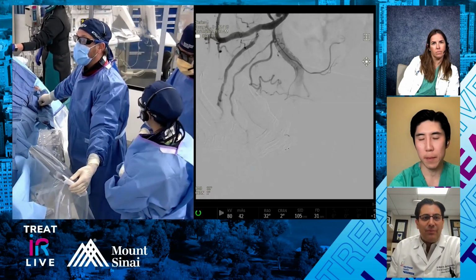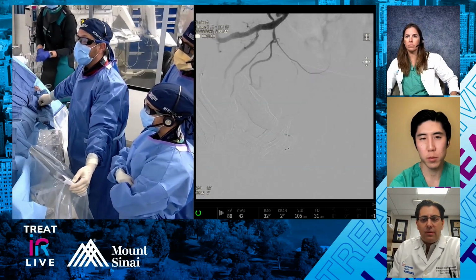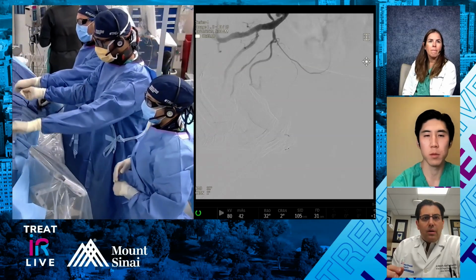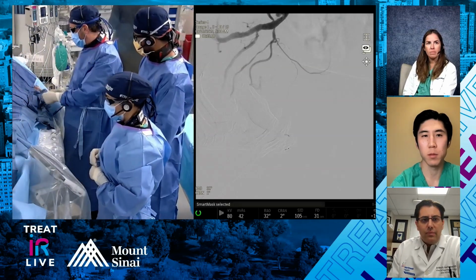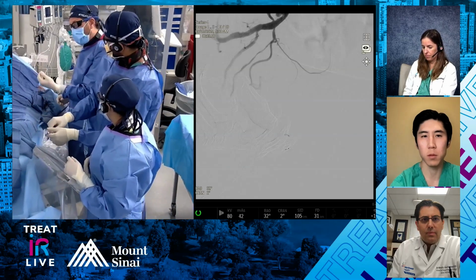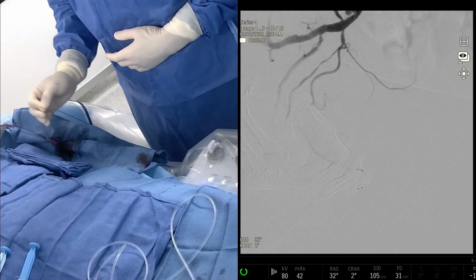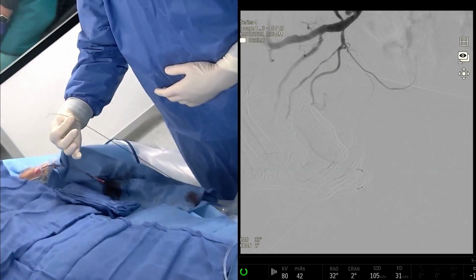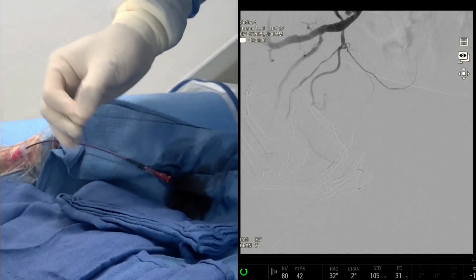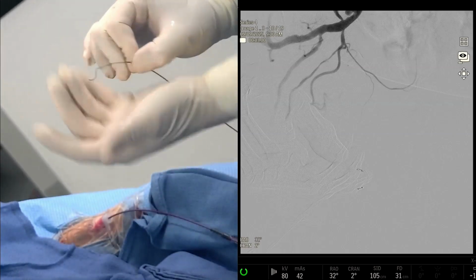I always use that catheter from a radial approach to start, and there's a couple reasons for that. The biggest reason is that I think it's very torqueable. It's sort of a great combination between something soft and something very torqueable. So I like that for radial access. You guys can take a look at our wire shape here real quick before we put it in. If you could just focus quickly on the wrist, you can see this curve has two angles on it. The first curve is a standard curve, and then we usually almost use like a question mark type shape here, and that's generally pretty good for getting into these arteries.